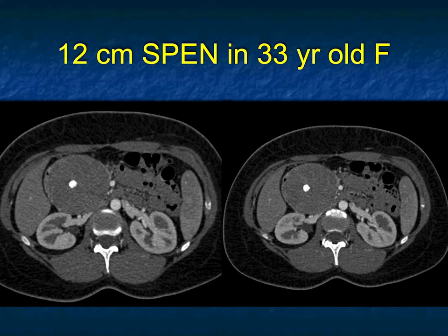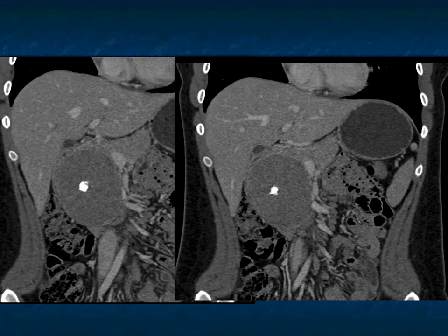SPEN tumors commonly calcify, though the calcification can be peripheral rather than central — central calcification pushes more toward serous cystadenoma. The average age for SPEN tumors is 19 to 30 years old, with a nine-to-one female predominance, though we do see men and also younger patients as young as six or seven, as well as older patients over 50 or 60. It's a diagnosis across a range of ages. Here's the same patient shown in a nicely detailed coronal view.